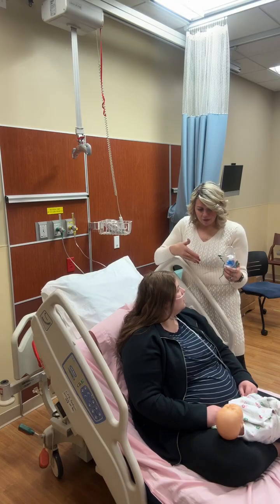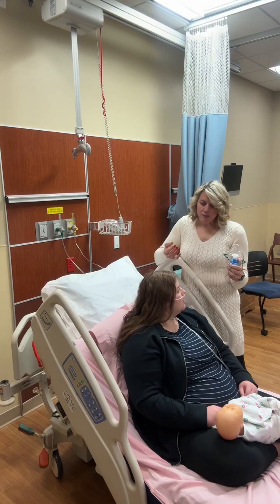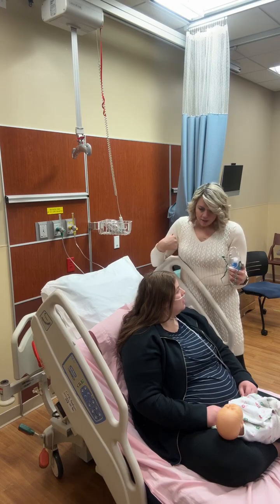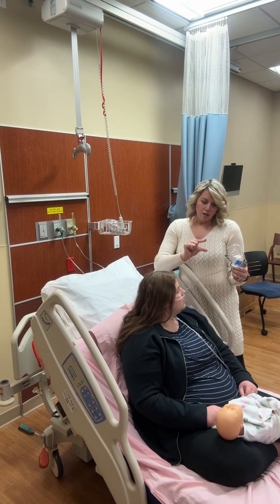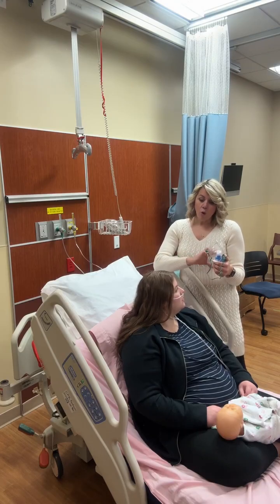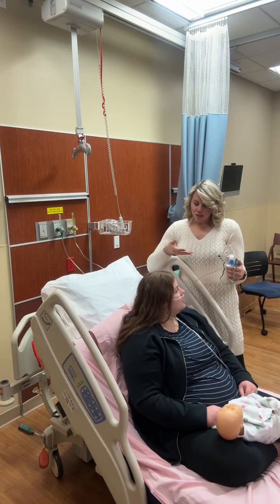So Ashley, this is a nebulizer, and the medication that I'm putting in here is albuterol, and it is a bronchodilator, which basically just means it's going to dilate or open up the bronchioles, which is a big word for the tubes that go to your lungs. And so what we're wanting to do is open those up a little bit better, because right now they're constricted, they're closed. And so think of a straw. When you squeeze the straw, you can't get any air through. So that's kind of what's happening to your bronchioles right now. So if we give a bronchodilator and that opens it up and allows you to take a deeper breath, it allows your oxygen to get deeper and oxygenate you better, okay?